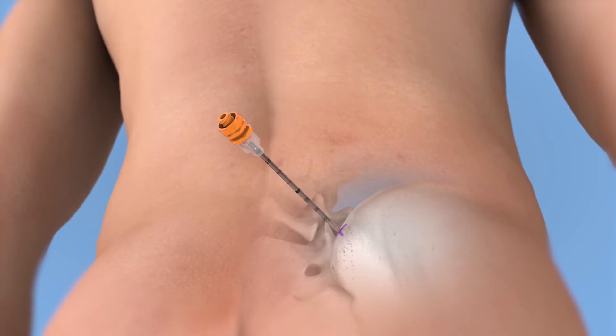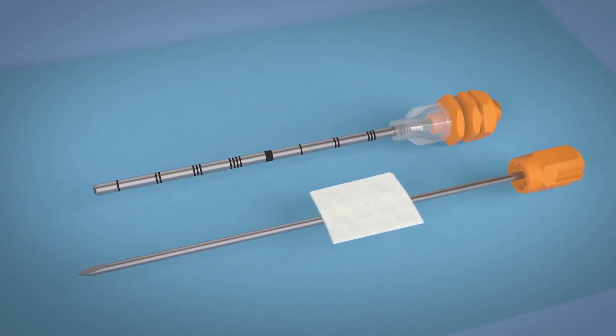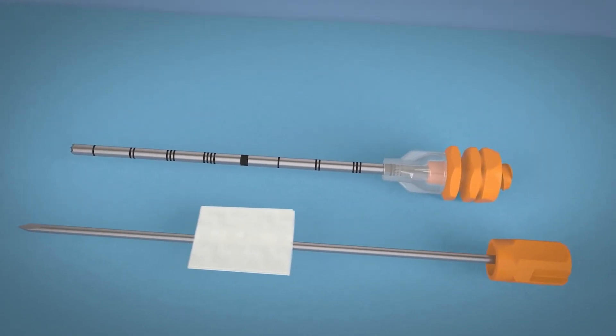Attach a syringe and aspirate the volumes ordered. Remove the cannula from the body with the driver or manually. Wipe off the stylet to remove any residue.